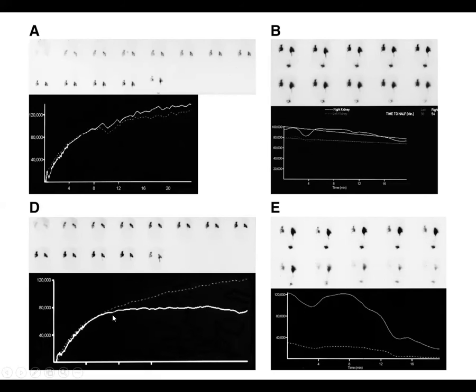On this part of the slide, we can see the obstructive type of the curve. Again, in both cases, the dashed line shows us the more obstructed kidney. Probably this is this kidney. Yeah, we don't see the passing of the radiopharmaceutical into the ureter at all, and this solid line corresponds with this kidney, which is also obstructed because we can see the radiopharmaceutical passed only to this level, yes, to the middle of the ureter, and it's also the obstructive type of the curve.